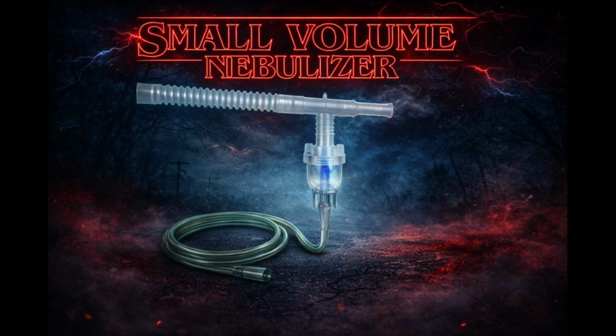A small volume nebulizer is a device used to deliver aerosolized medications directly into the lungs. It works by using compressed air or oxygen to turn liquid medication into a fine mist that the patient inhales. SVNs are commonly used in acute care hospitals, emergency departments, outpatient clinics, and long-term care settings to treat a variety of respiratory conditions.